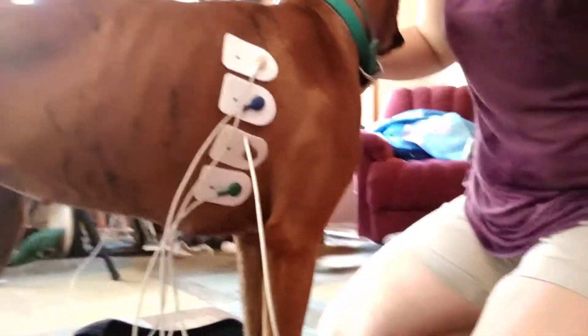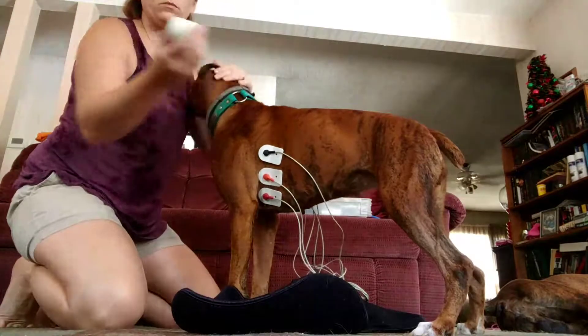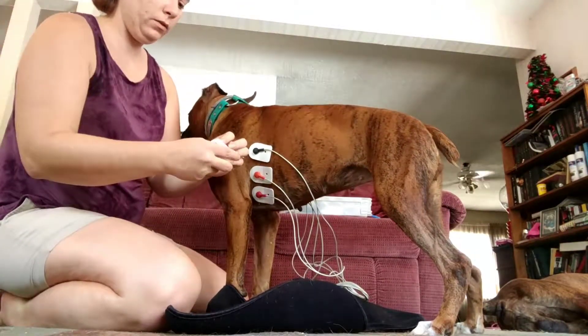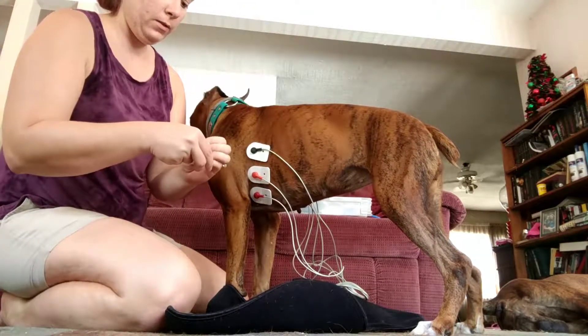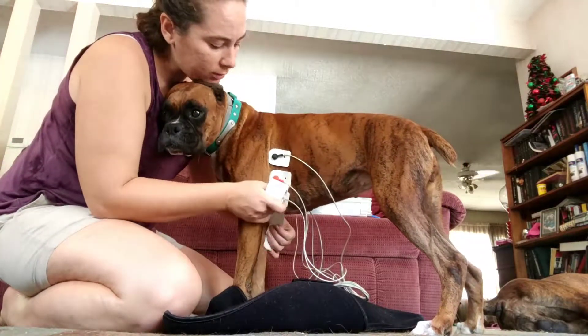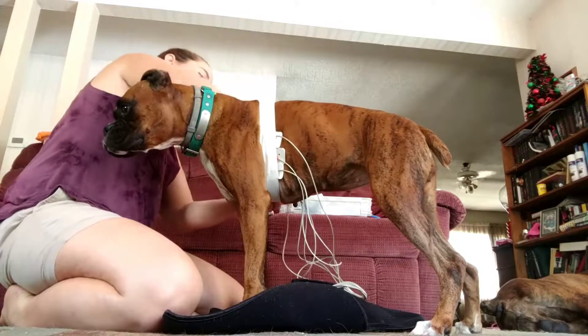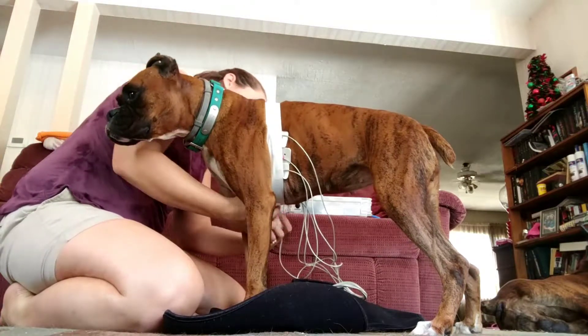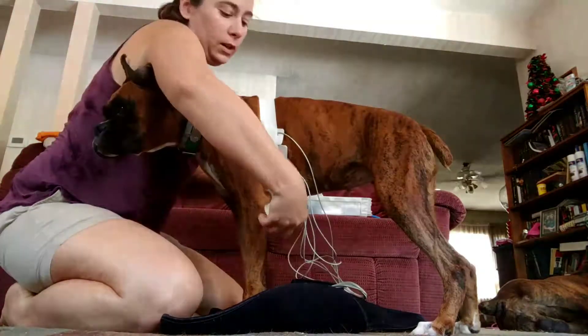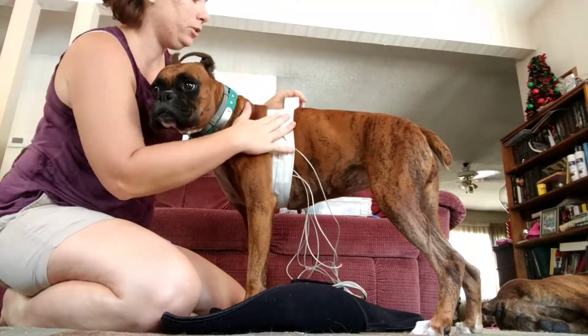Your last one will end usually just above the tit. This is what one side will look like, and this is what your other side will look like. Then take the sports tape — I do two wraps. I start it on the front side, put it underneath their stomach, go around — doing the front side first and then the back side. You're not doing this tight, just where it's on the skin.